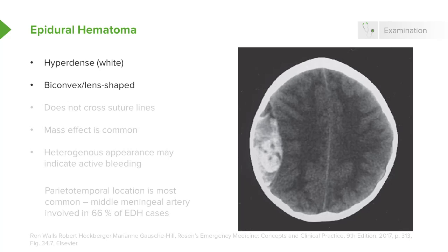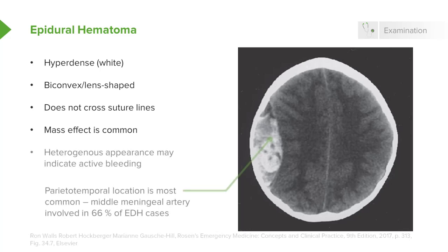If it's bowed out on both sides, that suggests that it's an epidural. It doesn't cross the suture lines. It's very commonly associated with mass effect, and on this particular CT, you can actually see the midline is bowing over to the contralateral side.